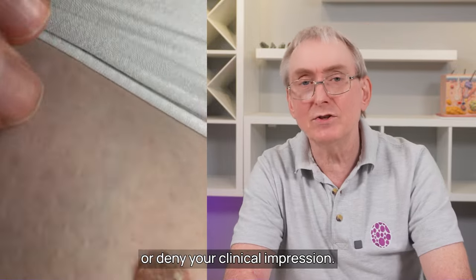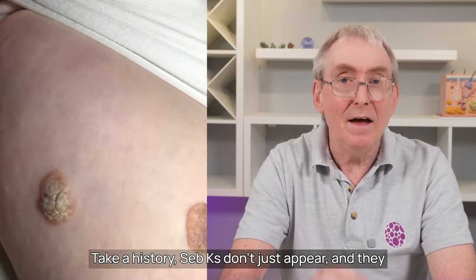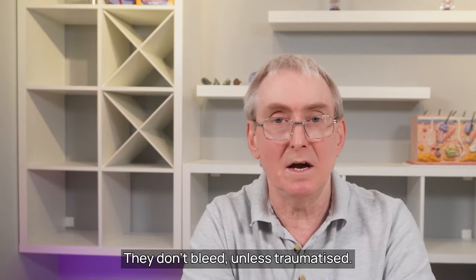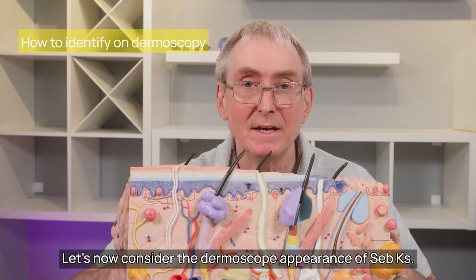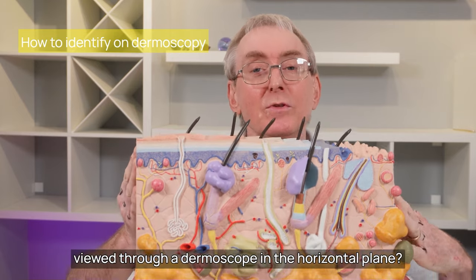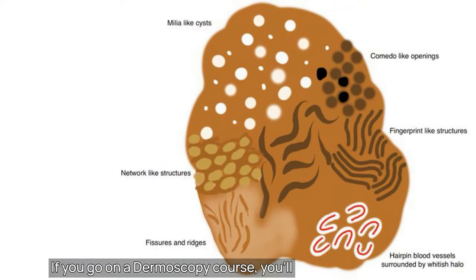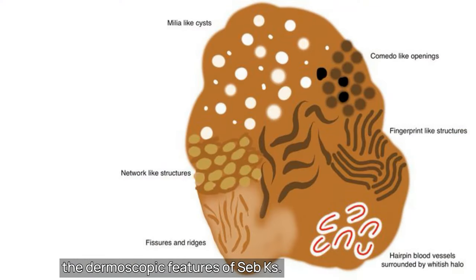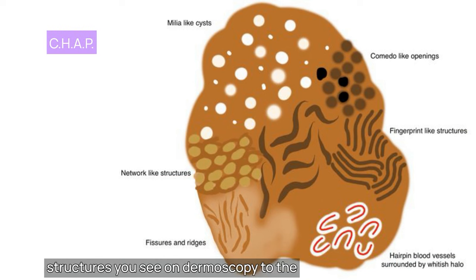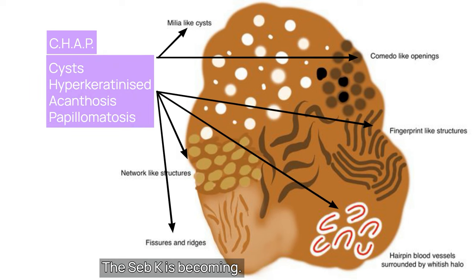Let's now consider the dermoscopic appearance of Seb Ks. What does this in-vitro 2D histological CHAP look like when viewed through a dermoscope in the horizontal plane? If you go on a dermoscopy course you'll be given a diagram to explain the dermoscopic features of Seb Ks. What I want to do is link the structures you see on dermoscopy to the developmental age and the kind of CHAP the Seb K is becoming. I've given this a name: the four ages of Seb.